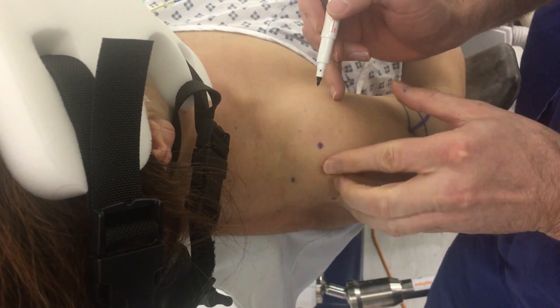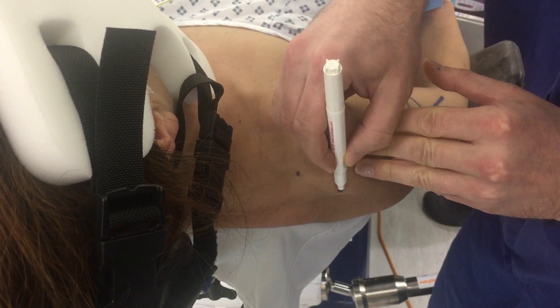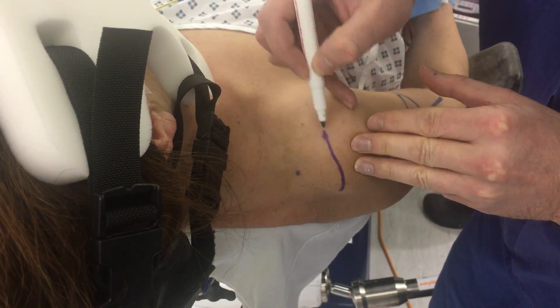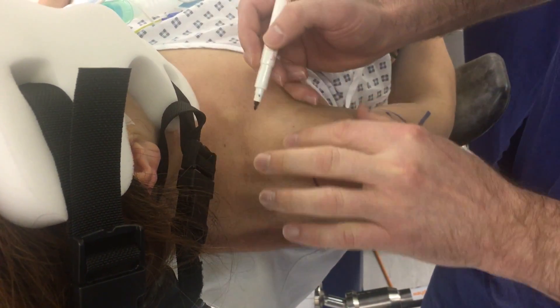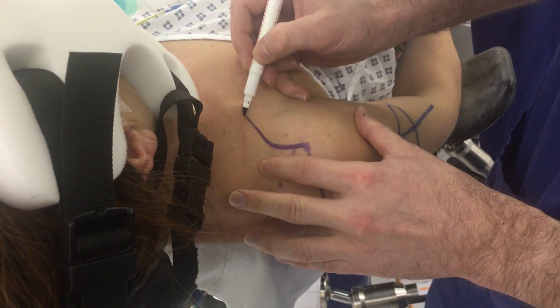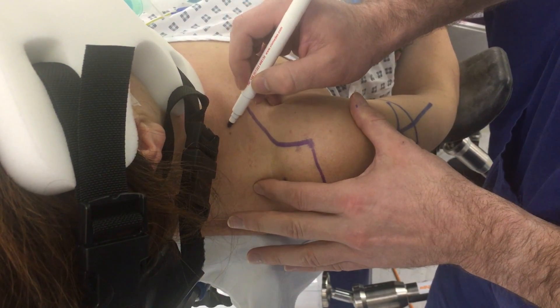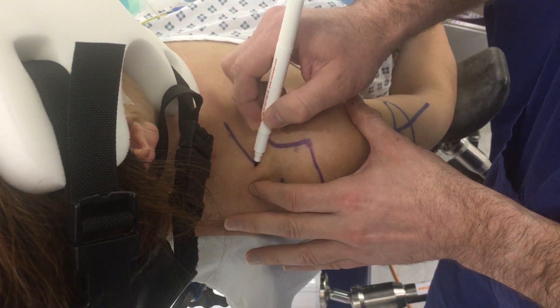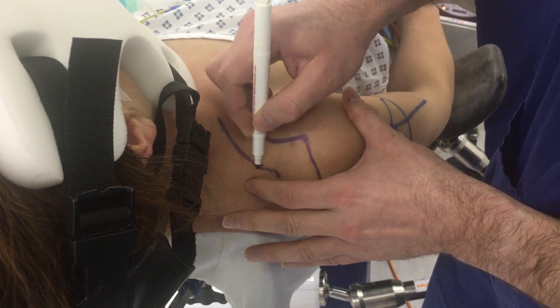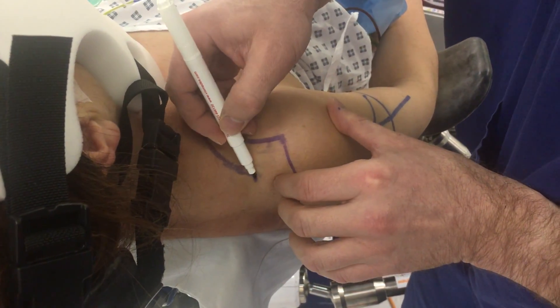You can then roll the edge of the lateral acromion with three fingers and join up those two lines, then follow the anterior acromion onto the clavicle and down the front, and then join up the back of the clavicle back to your Neviaser portal. That will indicate exactly where your AC joint is.